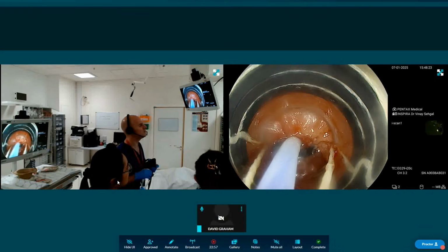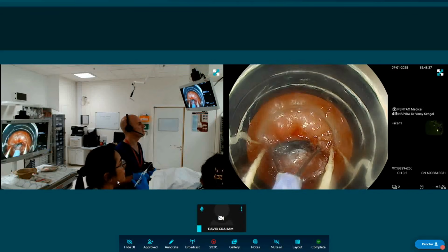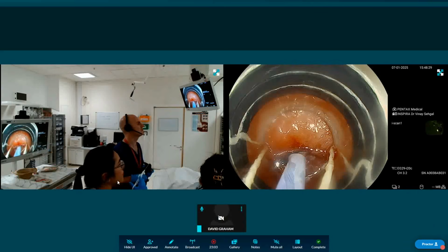And what that means is on the left band. So open the snare just a touch for me. And I'm just going to bring it back a little bit, try and reposition, try closing there.